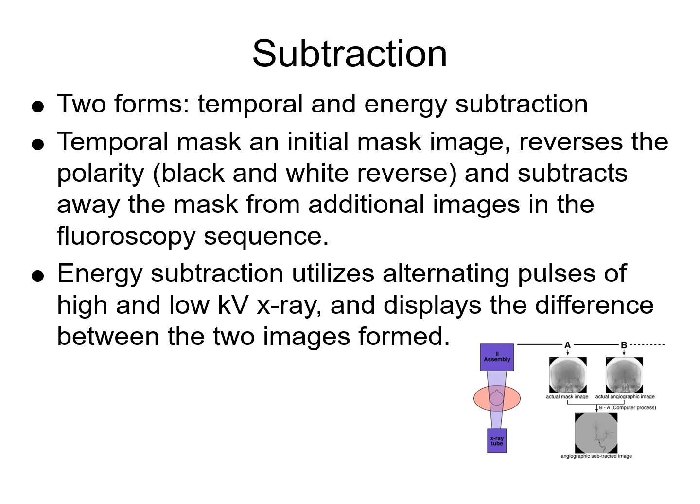What we do in temporal subtraction is we take an initial X-ray, just a plain X-ray, okay? But it's digital. And so the colors that you see, the blacks and the whites and the grays, those are all really intensity values stored in computer memory, okay?